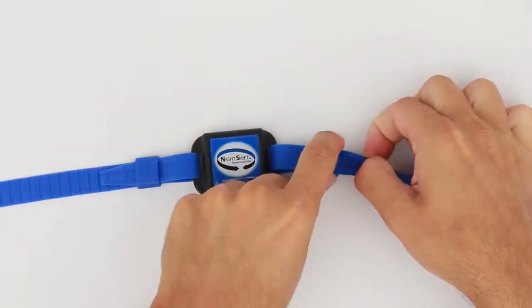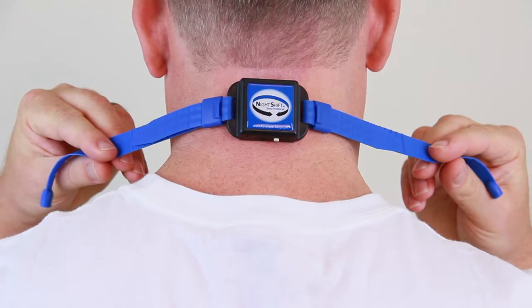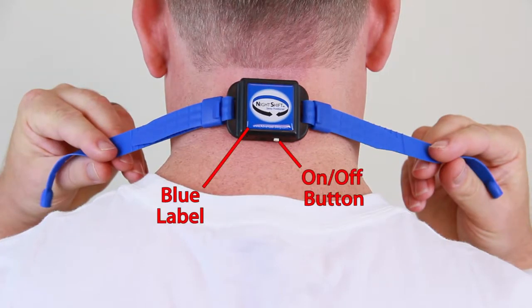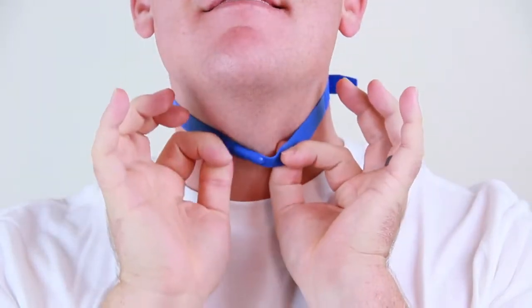Repeat this process with the other side. Center the Night Shift on the back of your neck with the blue label facing out and the on/off button facing down.